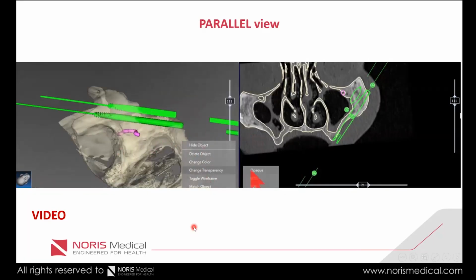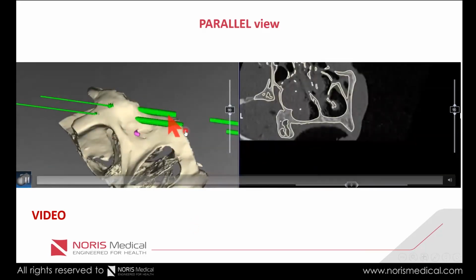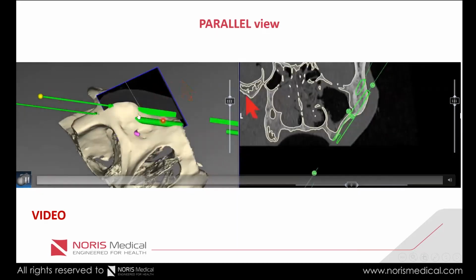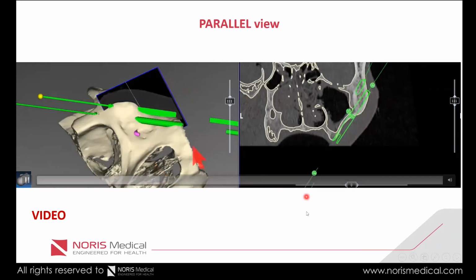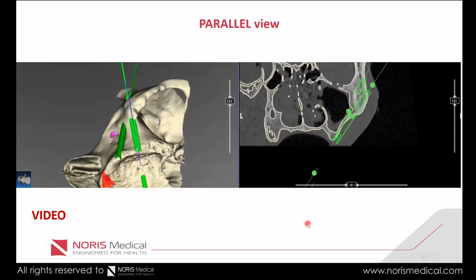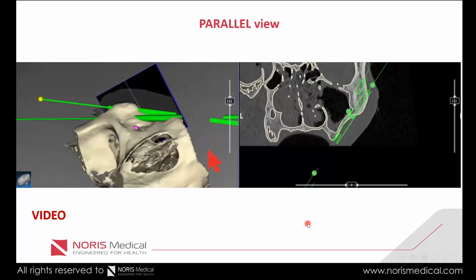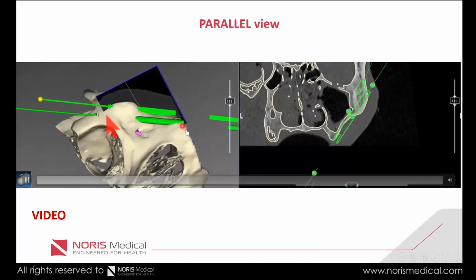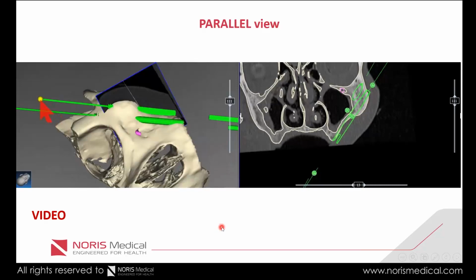Okay, so if we have a distance, when we position our face in such a way that we have the implants parallel to one another, and we have a distance between the implants, this distance here, that means that they're not colliding. This is the distance that they have. So we actually move our face to this angle until we see the implants parallel, and we measure with our eyes if there's a distance here or not, okay?